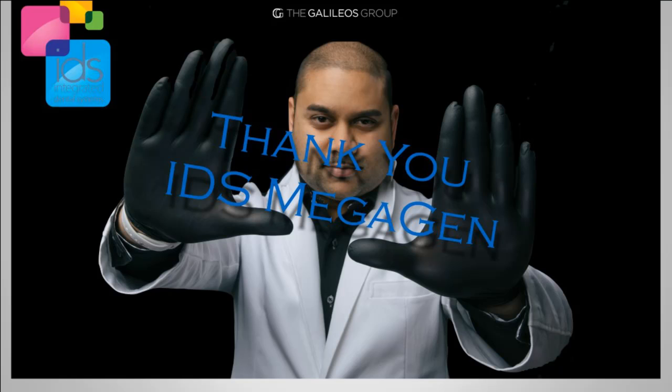Remember that the scan body was the white cap or the gray cap. Furthermore, when the tie base is seated too far subgingivally, it becomes very difficult to retrieve or remove from the patient's mouth during the scanning process. The scan post was created specifically for intraoral scanning. So it's my opinion that anytime you want to scan intraorally, it's to your best advantage to use the scan post for intraoral scanning.